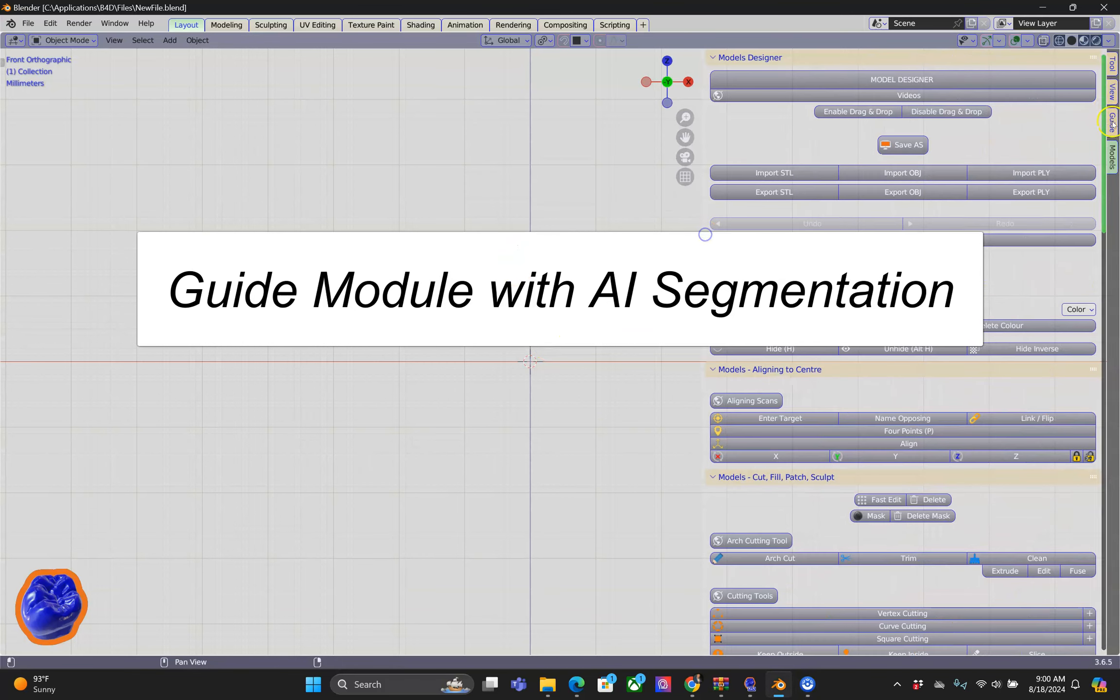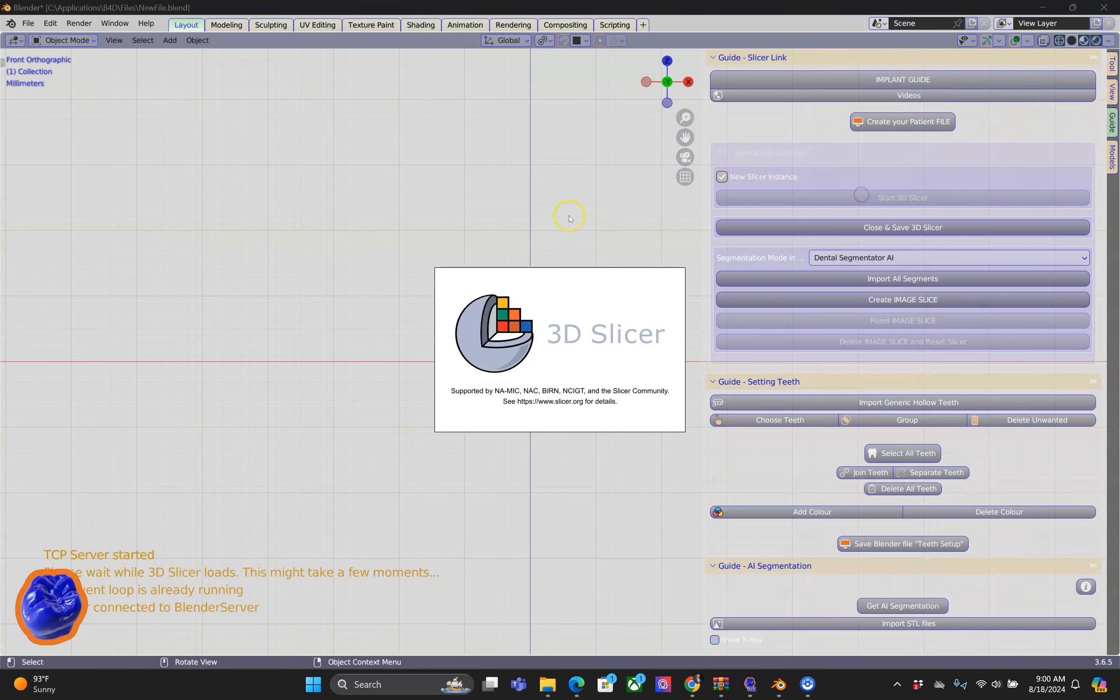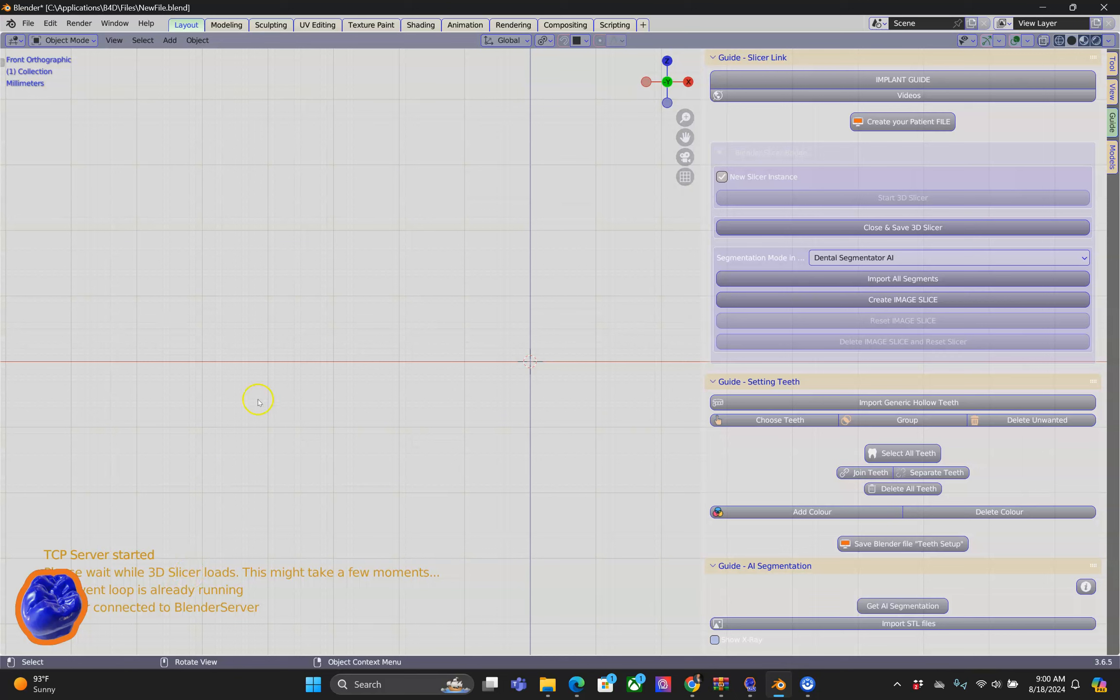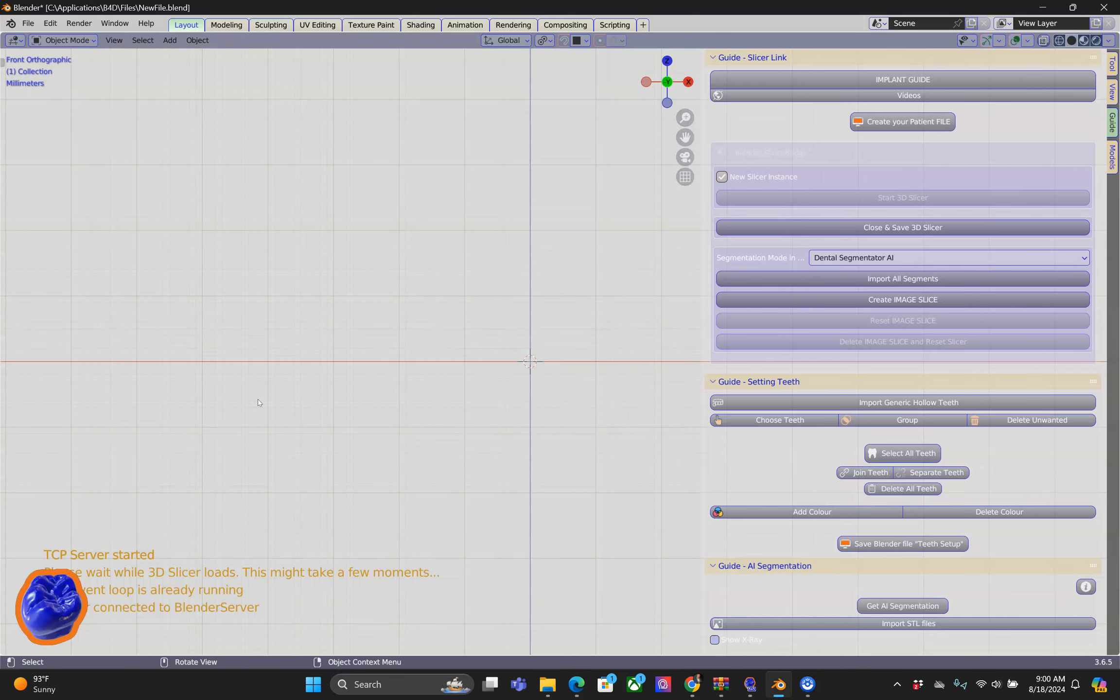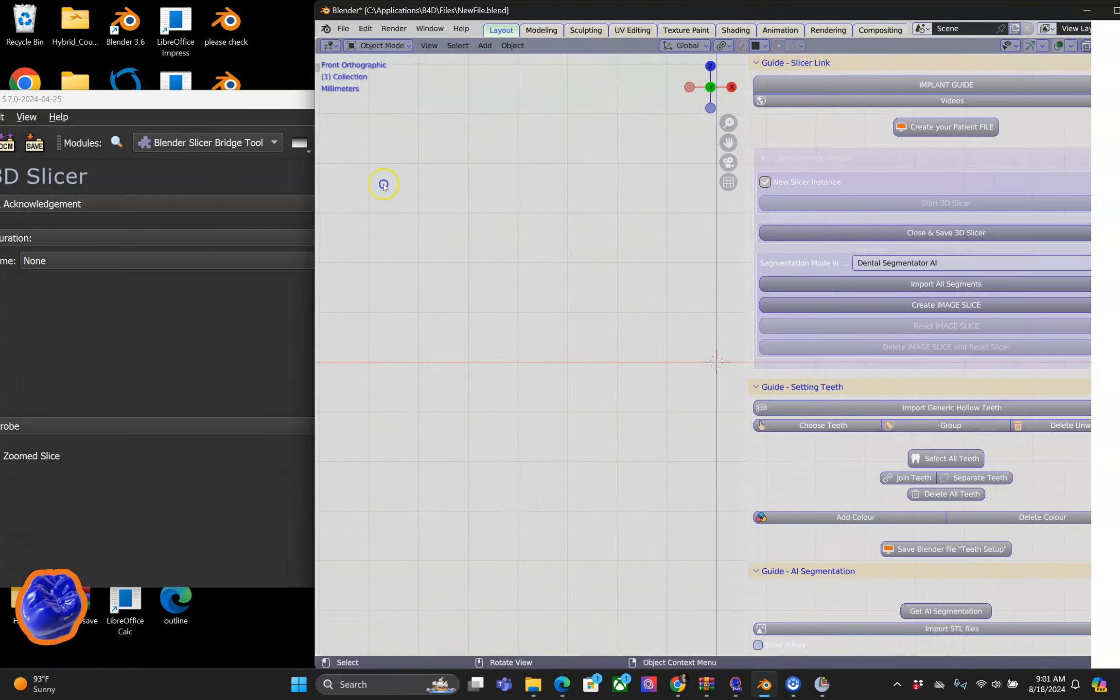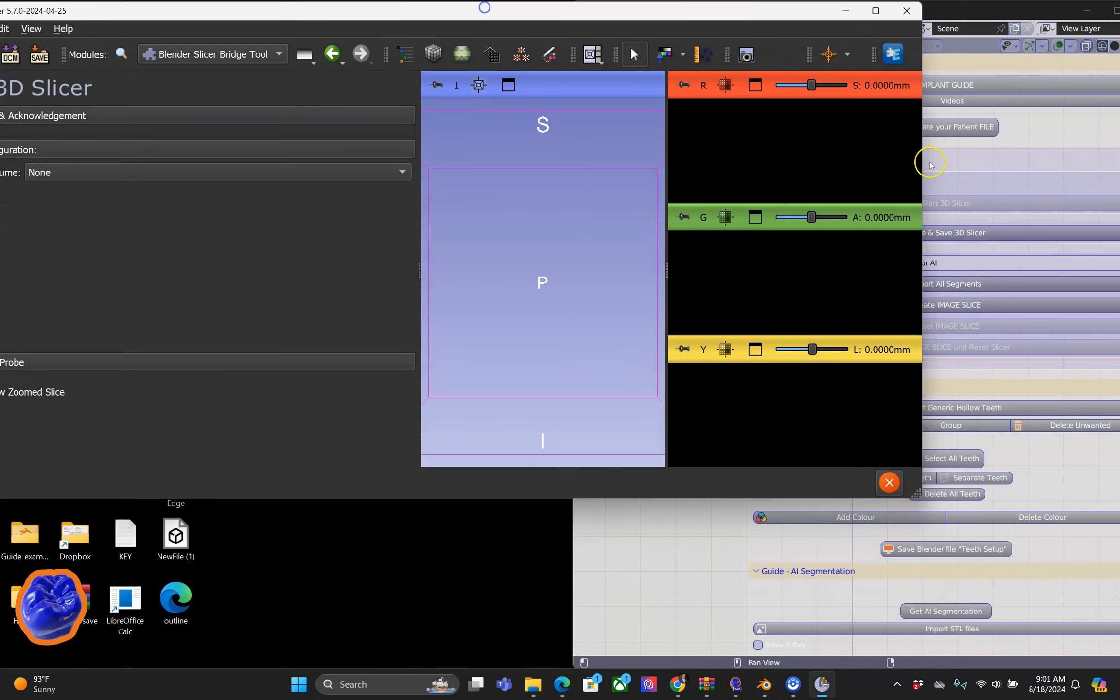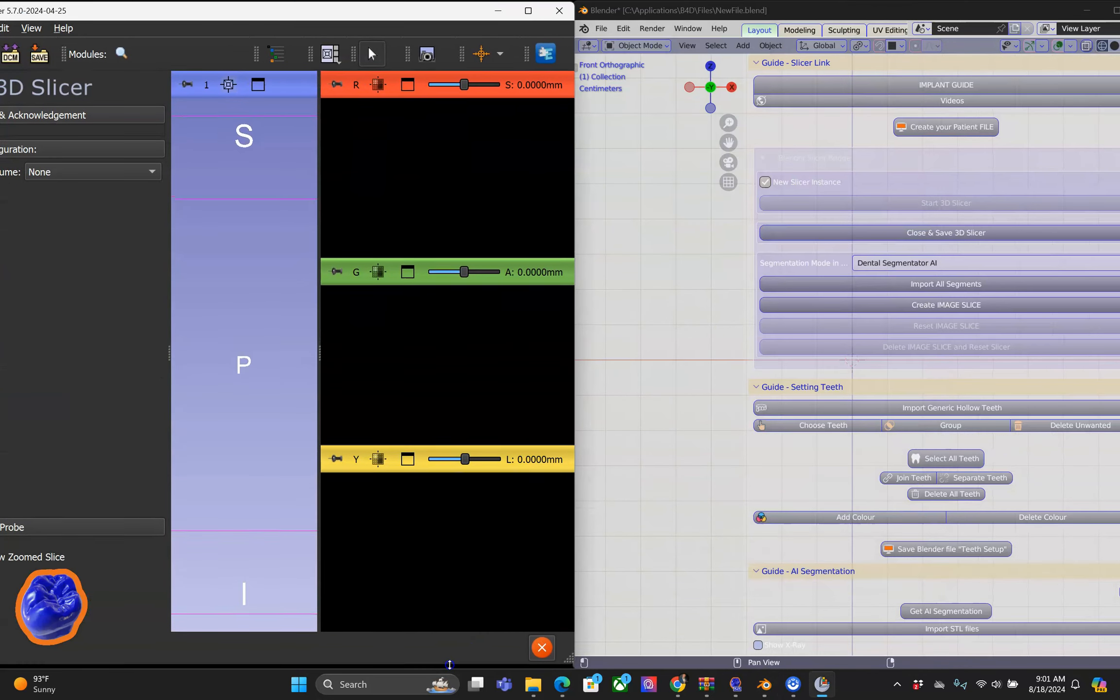The guide module is truly remarkable. Have a look at this. I'm going to open 3D Slicer, which is an application that works in unison with Blender, so the two programs talk to each other.